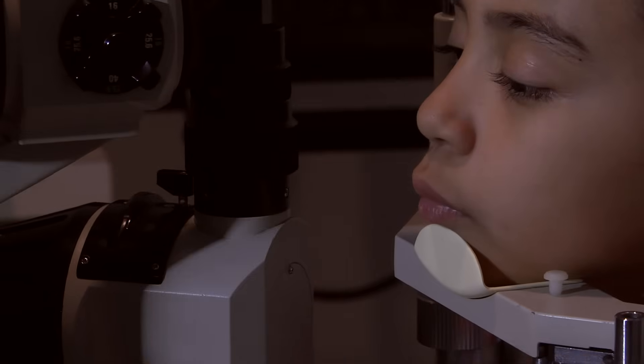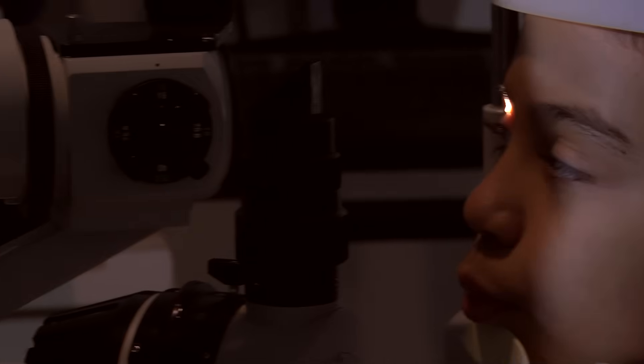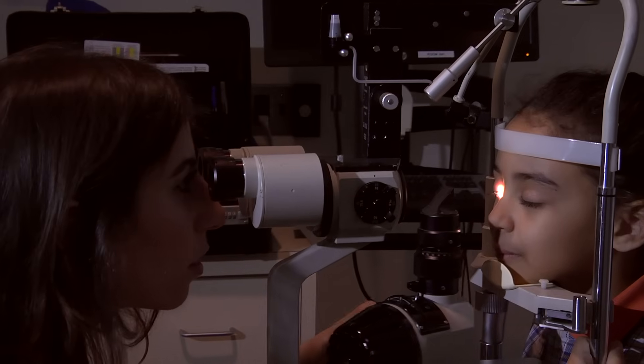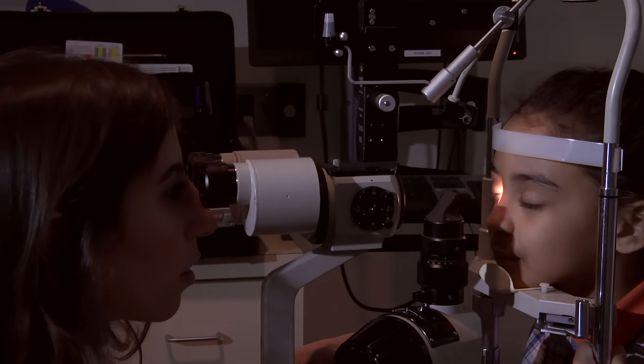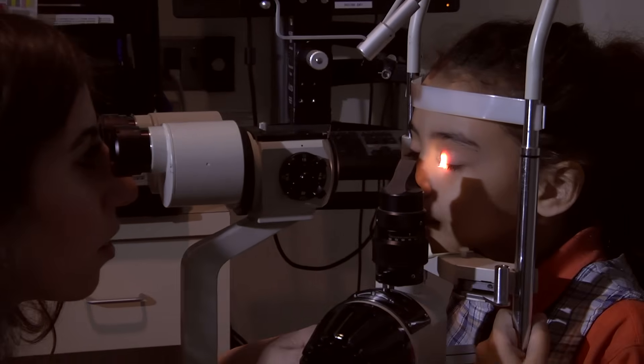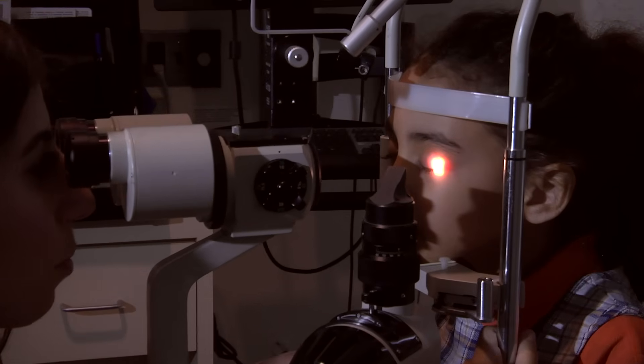Once this is done, we put the child behind what's called a slit lamp. This is just like a giant microscope to get a good look at the front surface of the eye. This will give us a good understanding of how healthy the front of the eye is.